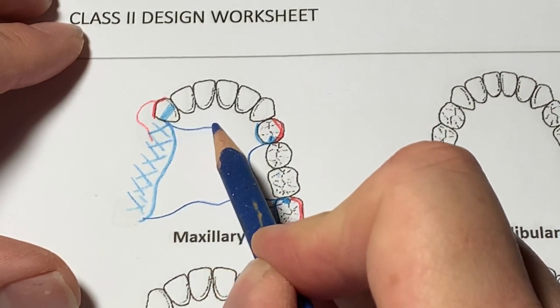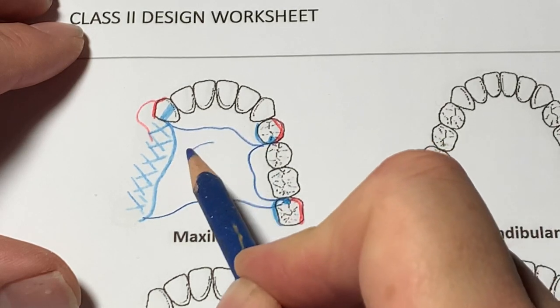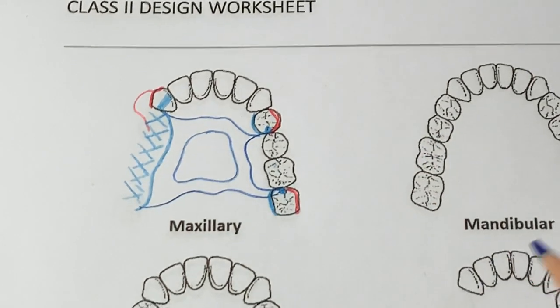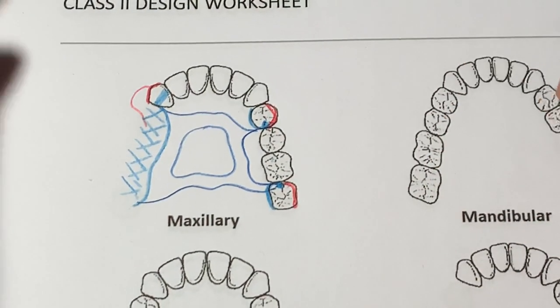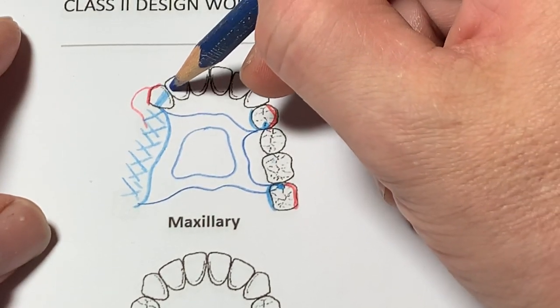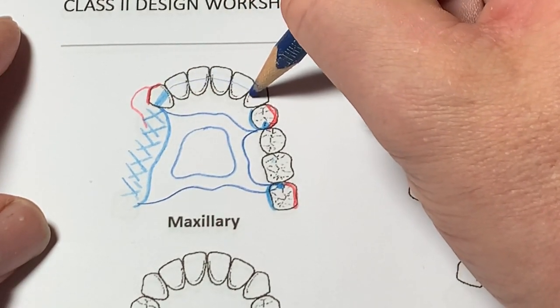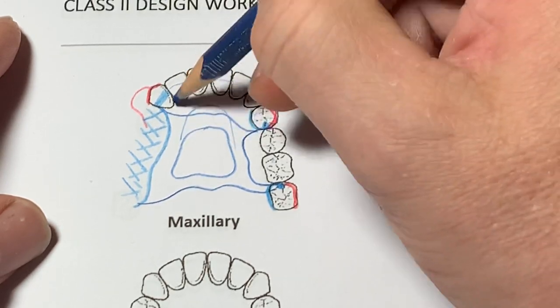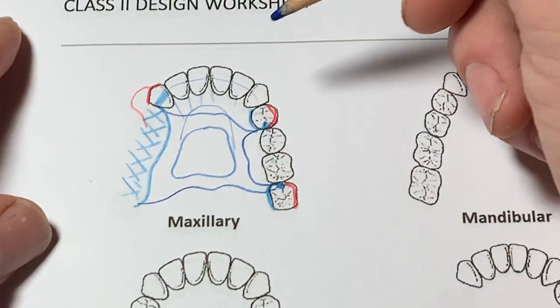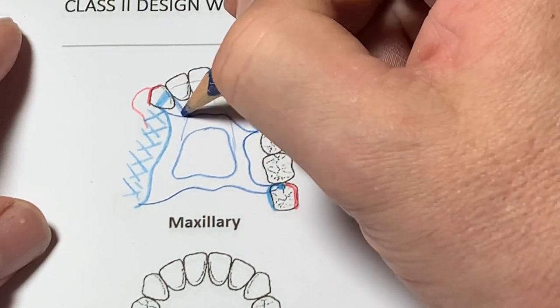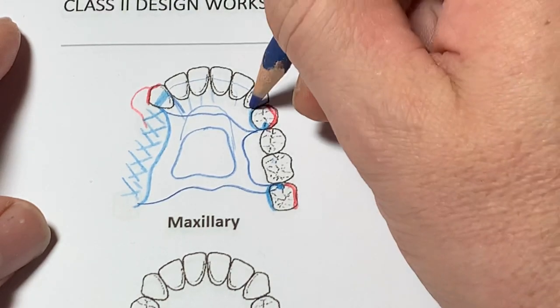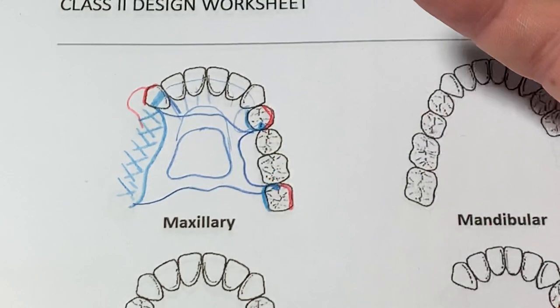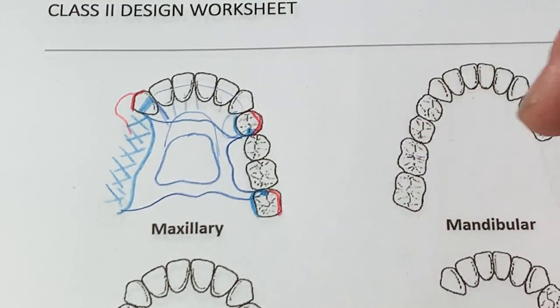For free ends of Class 1 and 2, it's prudent to extend the major connector as far posterior as possible. We could exercise an anterior palatal strap — a large one — or an anterior-posterior palatal strap; either would work, and obviously less metal is better. If you wanted more indirect retention, you could Kennedy bar the whole anterior, plate up here, or just apron the canine with a minor connector.